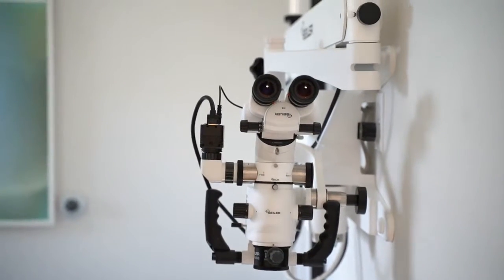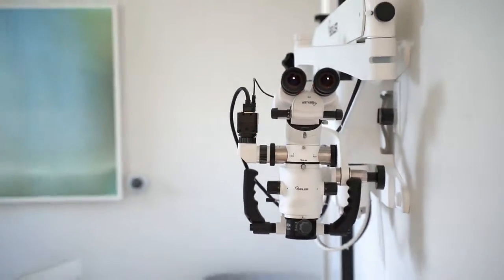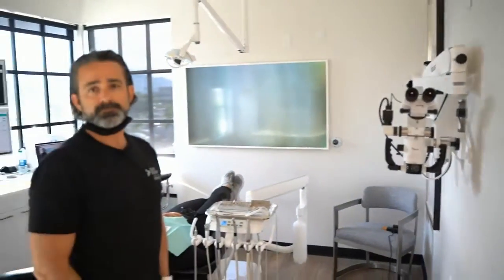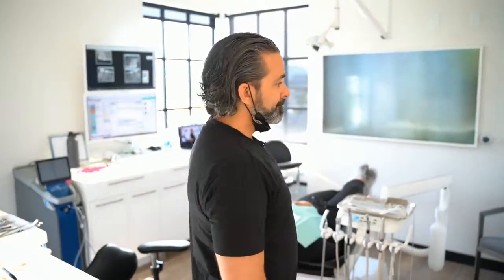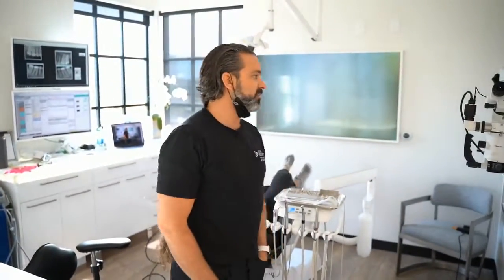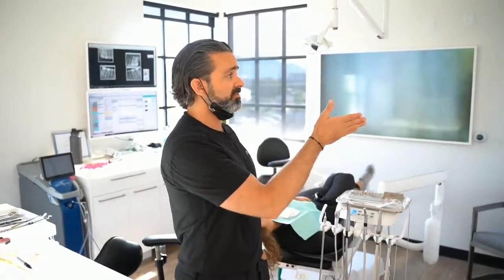How about the paradigm shift of going from a non-microscope user to somebody adopting a microscope, learning how not to revert back, but really implementing it day to day? Any ideas? Yeah, so the question was, you've been doing loops for how long? What would make you want to go to Seiler?